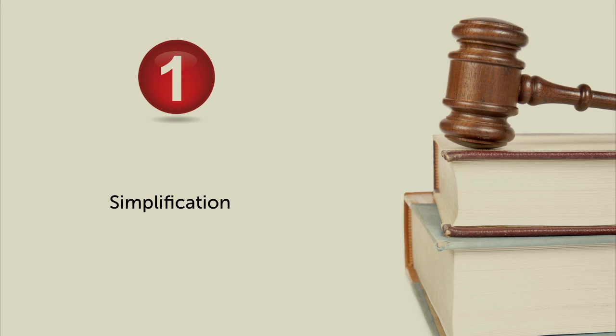Hello. Okay, so Martin, you said simplification is more or less the topic. Do you think the guidelines achieved that up front? Partly. They partly achieved it. I think they gave us fewer parameters to guide us through the jungle of diastolic function. So yeah, partly they achieved this goal. Yeah, I think this is also what I believe, but let's go through it.